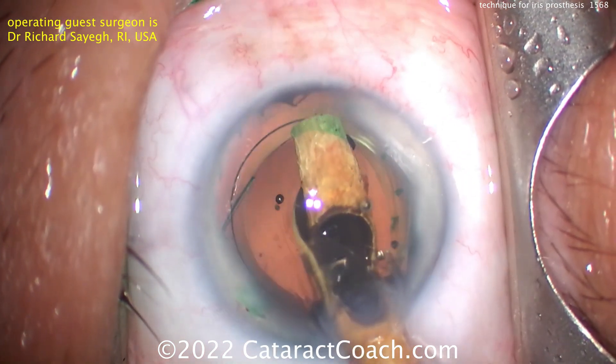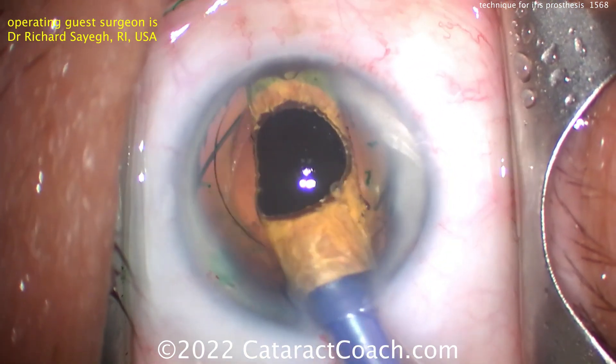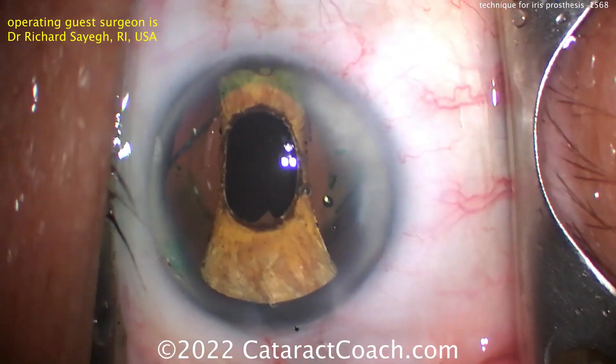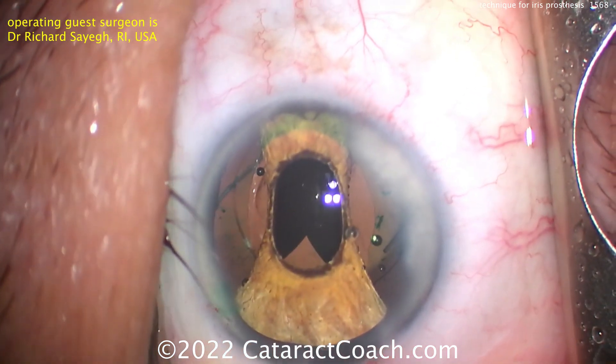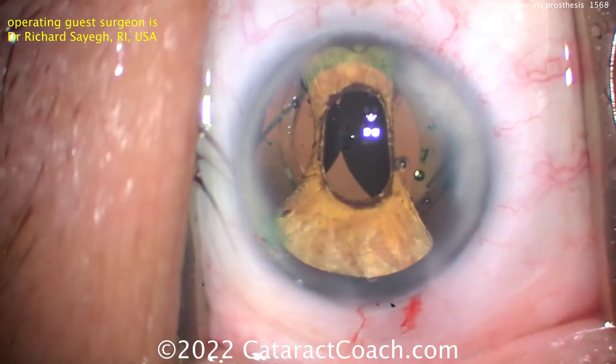Injecting it inside the eye — it's been folded up and placed into an injector. Importantly, getting it under that nasal capsulorhexis edge. There it is. And now you can see the benefit of that green dye staining. Now you're going to open up the two side wings, then go opposite from the main incision.